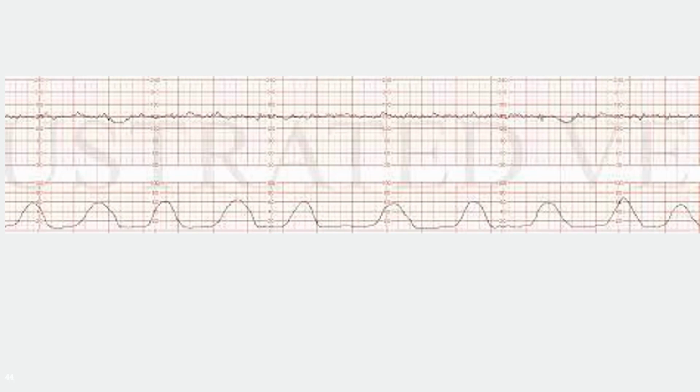Okay, now this is tachysystole. This patient is contracting too much, and you can see that being reflected in the fetal heart rate. You have minimal variability. It kind of looks like there's a couple little dips up there, but you've got to get that pattern gone. You've got to space those contractions out because this baby is responding with lower oxygenation.